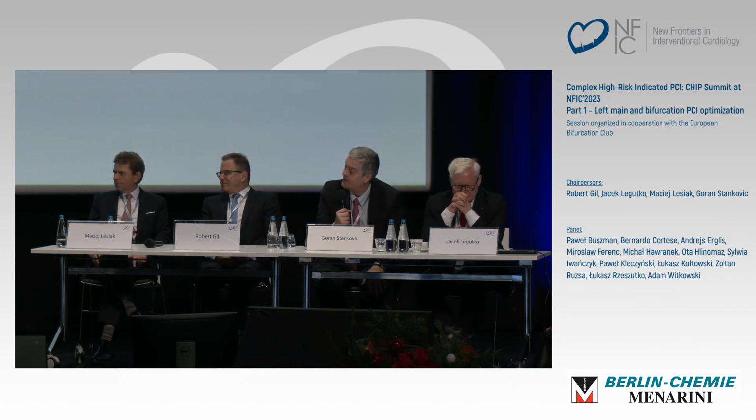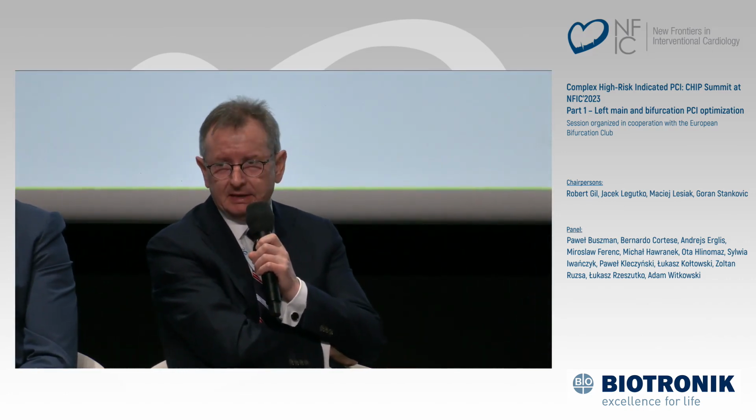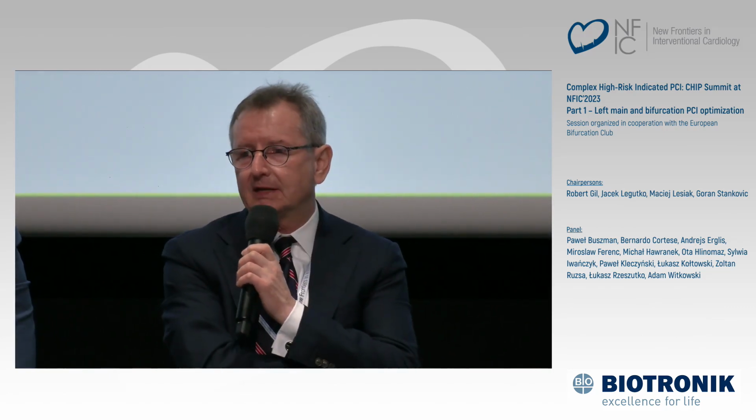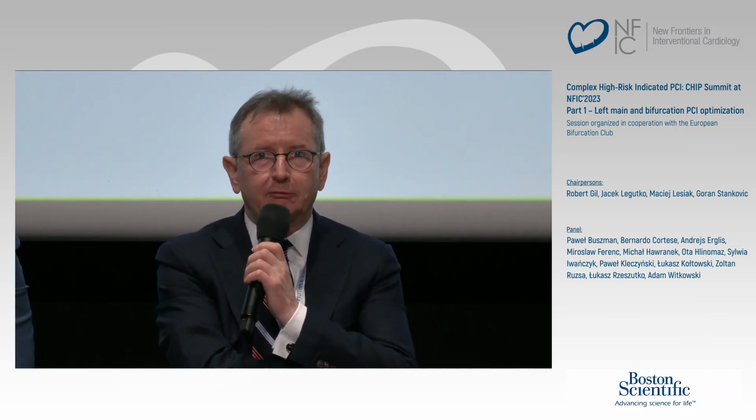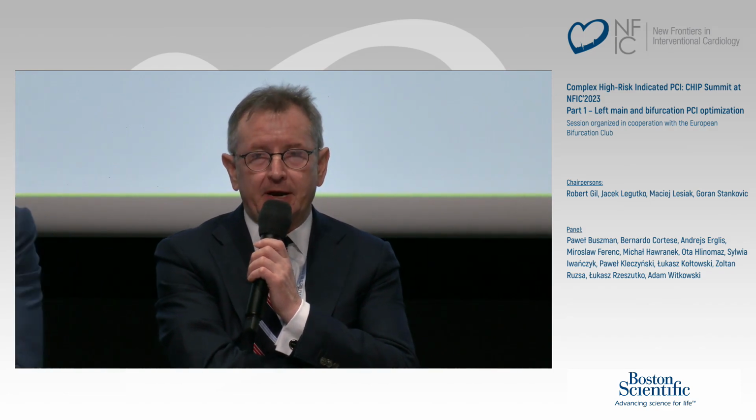okay, we go. Yeah, congratulations to Jacek and his team. Finally, you could achieve very nice result. But what I know, probably not everybody in every cath lab has IVL to treat patients with calcified lesions, at least today. And what will be the option if you don't have such device in your cath lab? Would you use NC balloon with very high pressure, or would you go with OPN balloon?